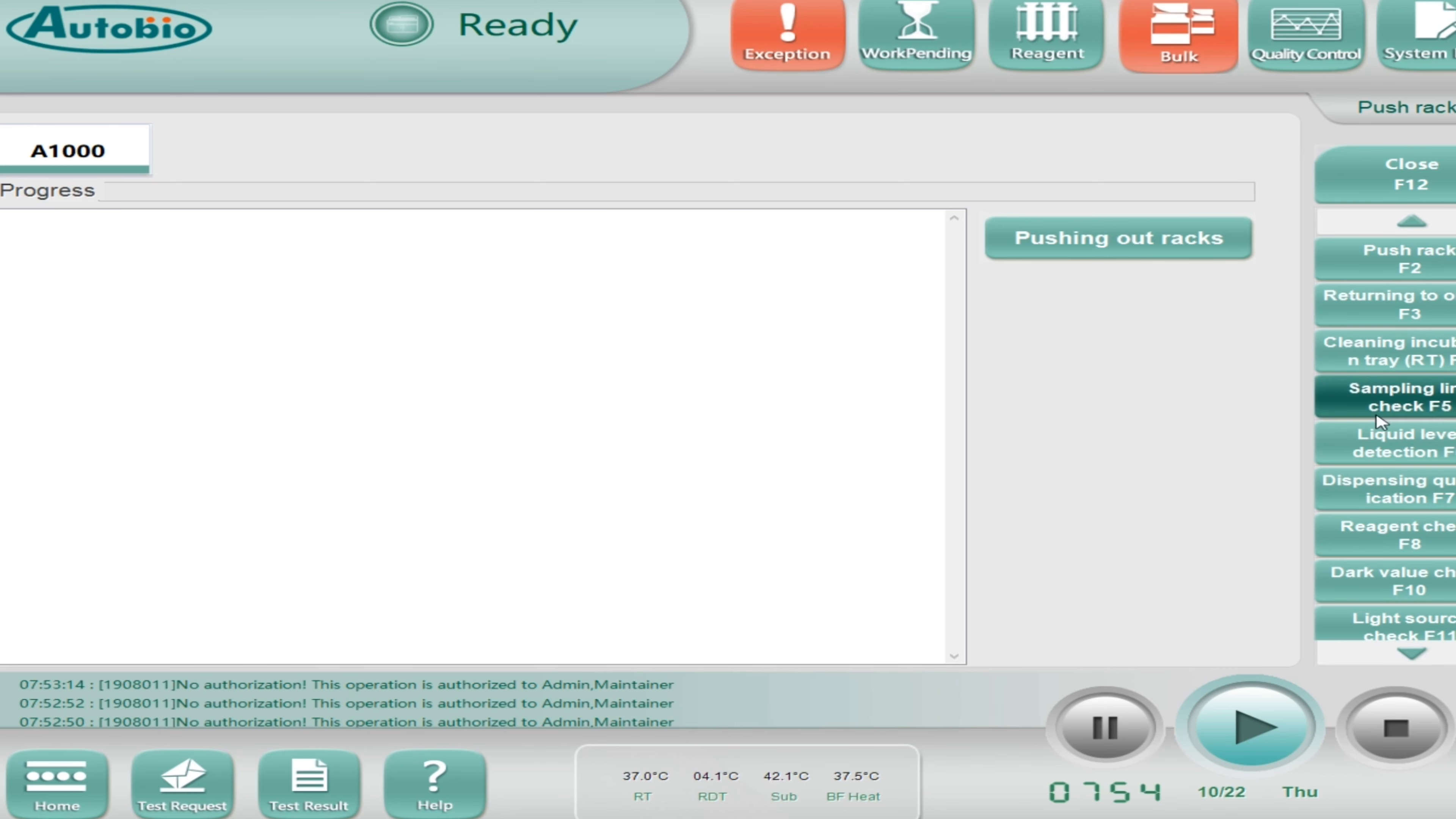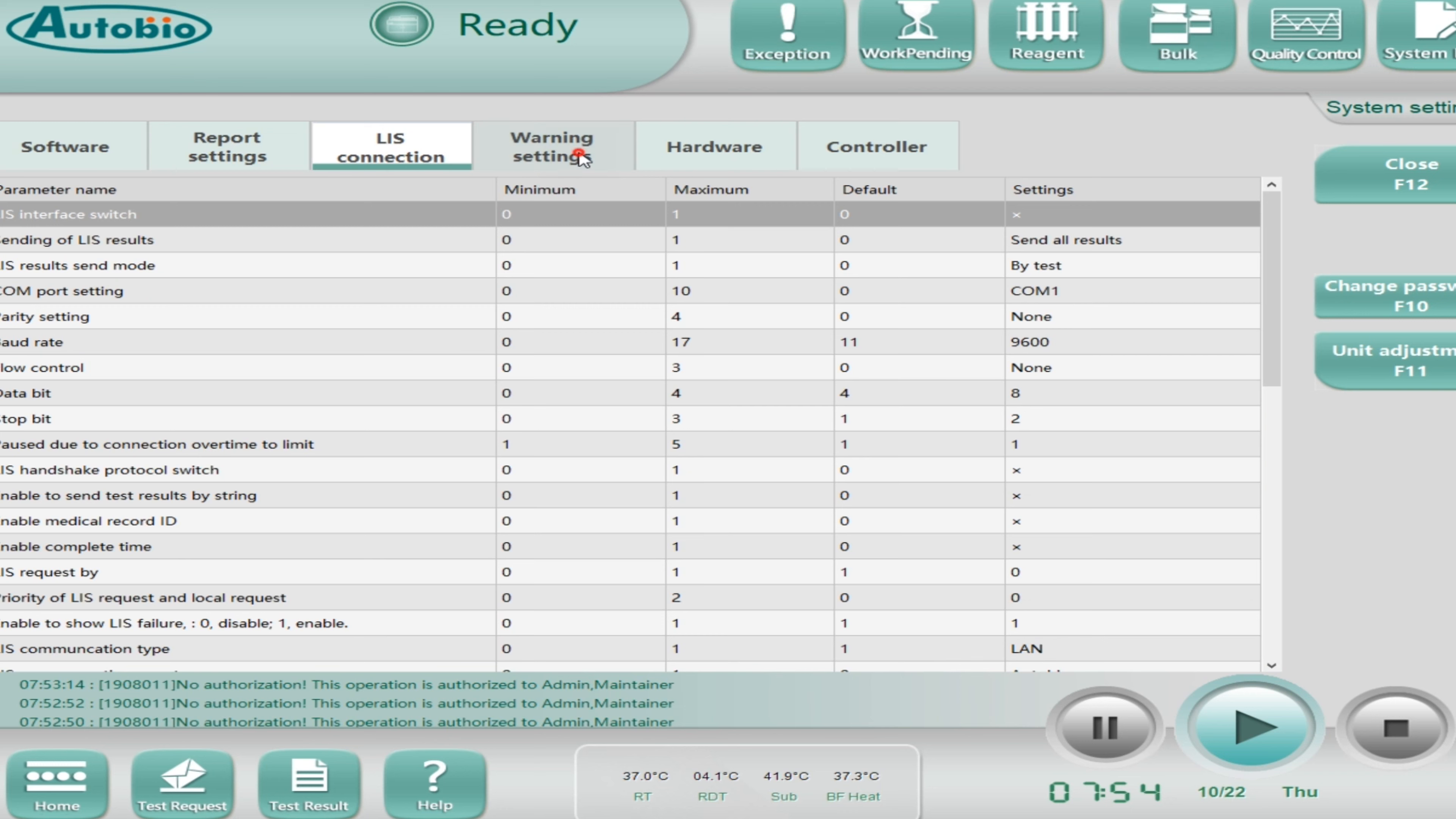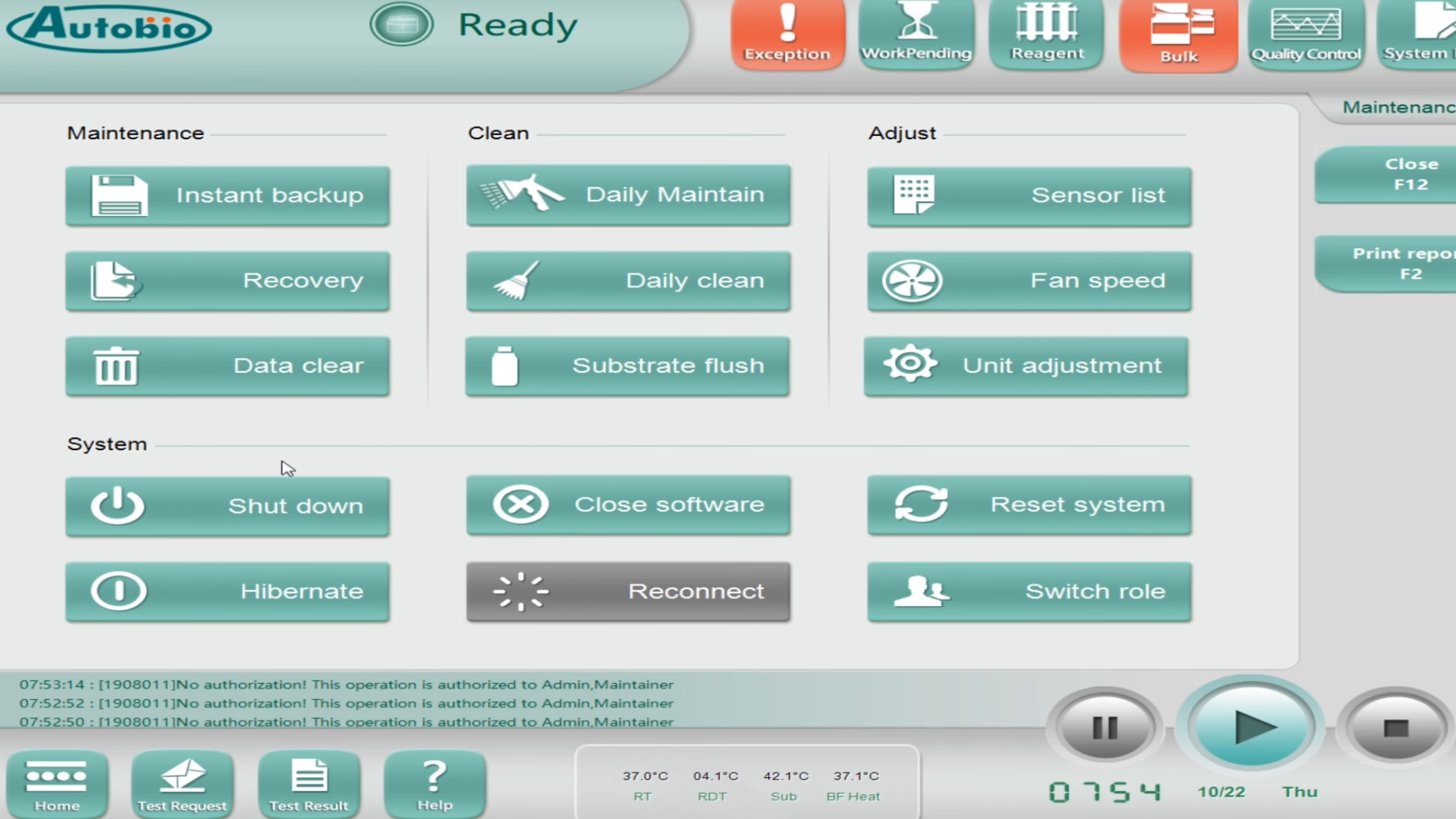Let's come to the next which is bulk. In bulk you can check the diluent, system wash, substrate wash buffer, purified water, waste and the RVs. Next is QC quality control, this one I will explain you later on. And the last one is the system log. Here you will find all the logs.